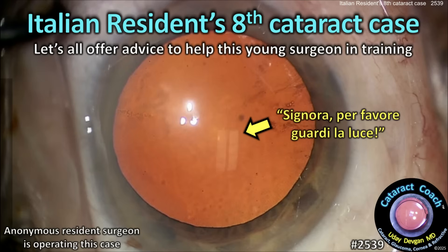CataractCoach.com — an Italian resident's eighth cataract case. Let's all offer some good advice.